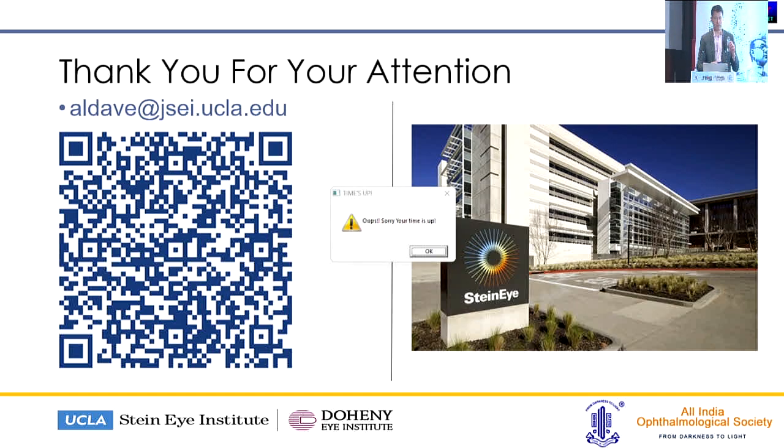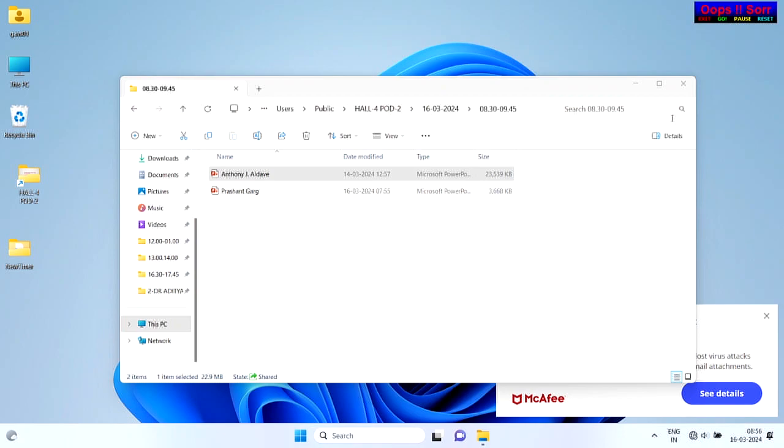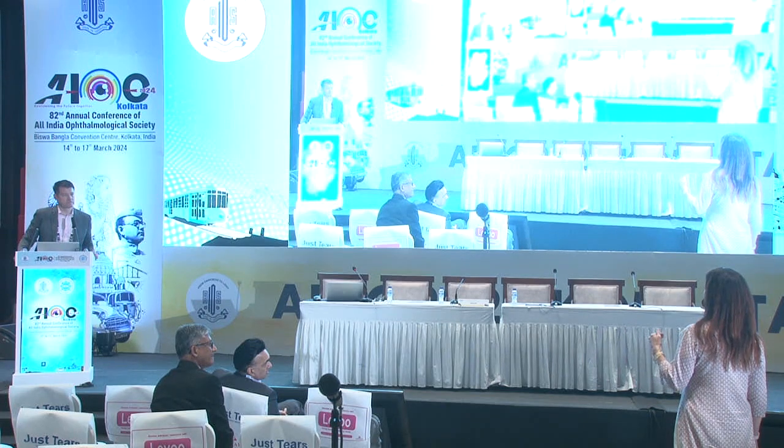Any questions or experience with the LAL from those in the audience? Tony, I agree. I really like the LAL in this situation. I just started to do them for DMEK, and it works very, very well, just for all of the reasons that you delineated. I wouldn't necessarily recommend it for PK, but in the DMEK and DSEK series, you have to be sure that the patient understands that there are going to be several light adjustments.